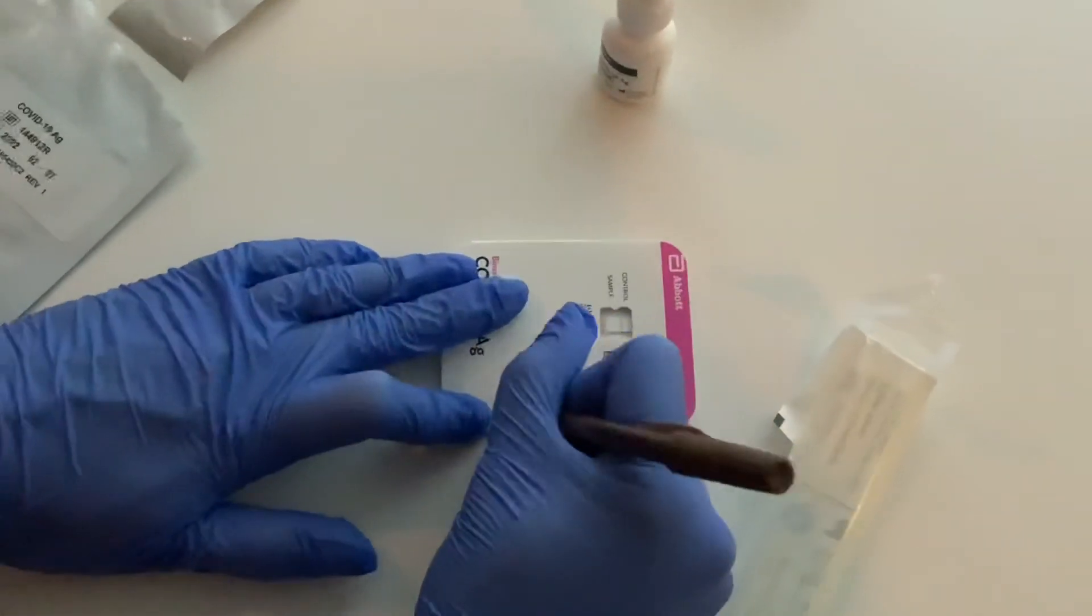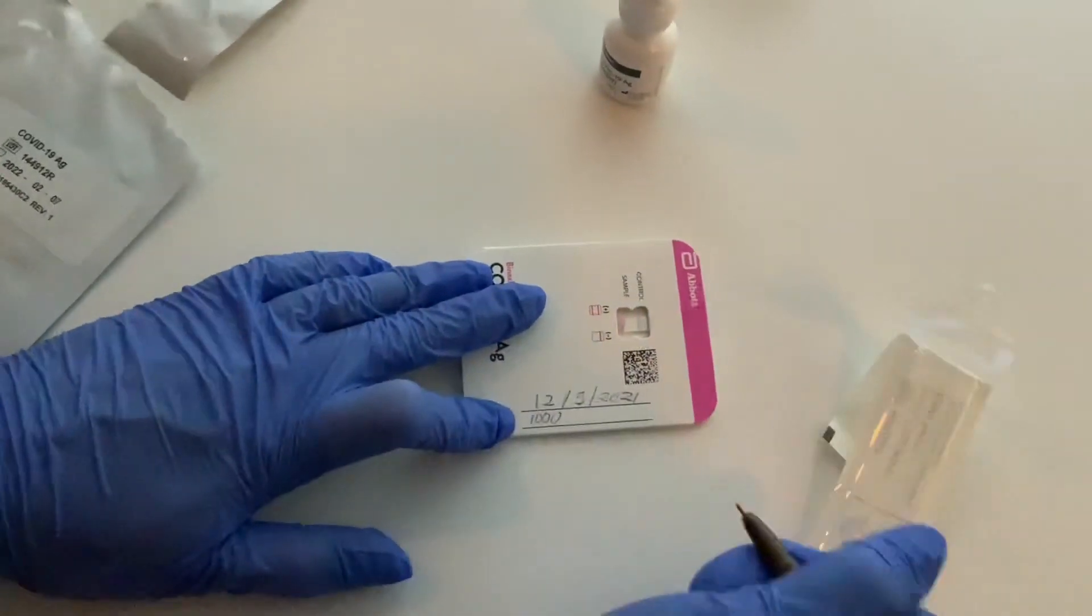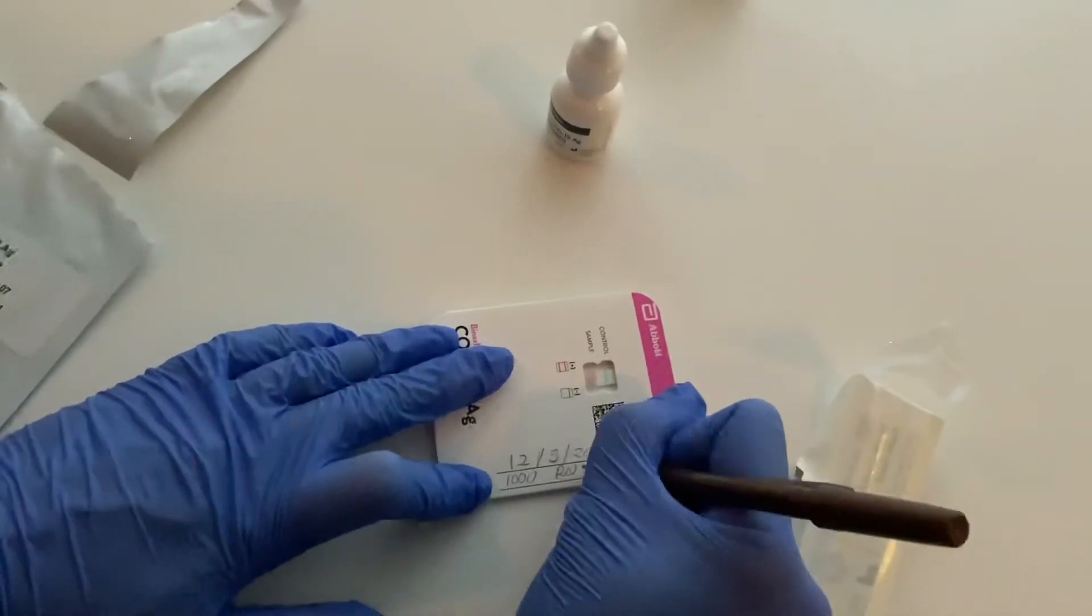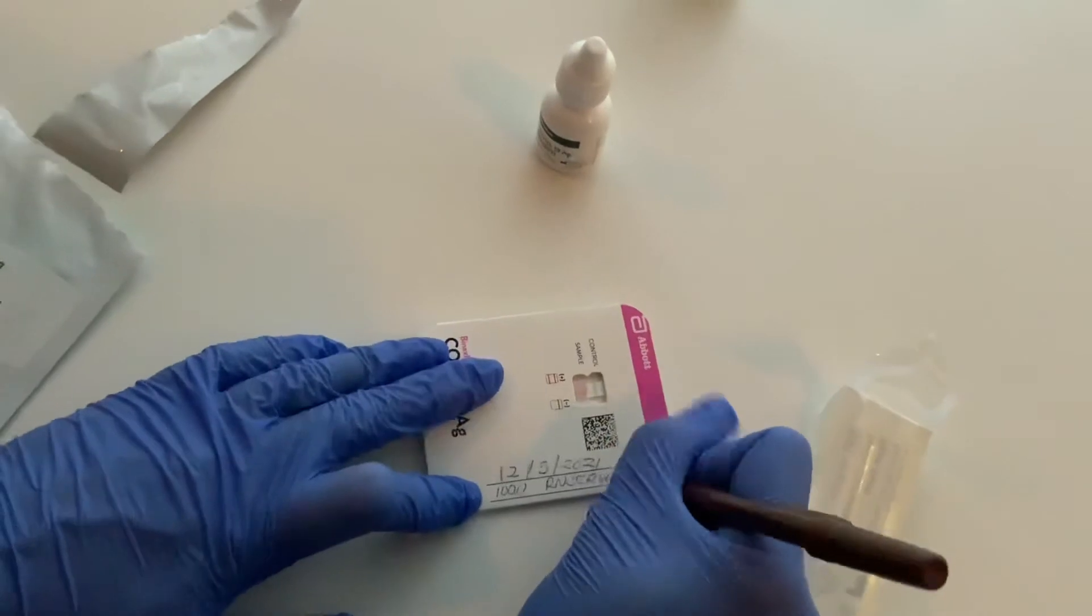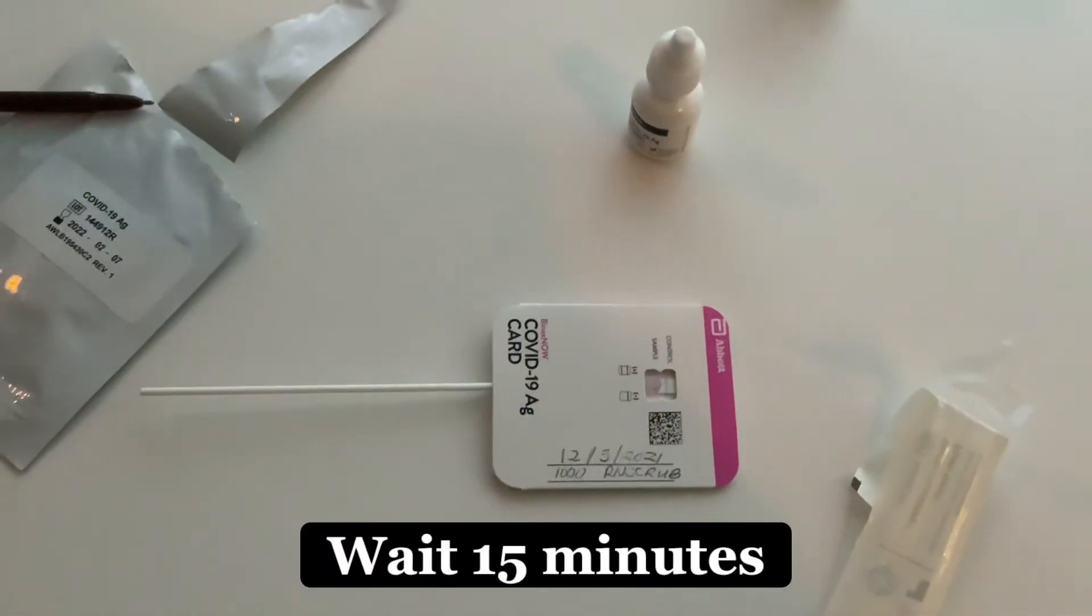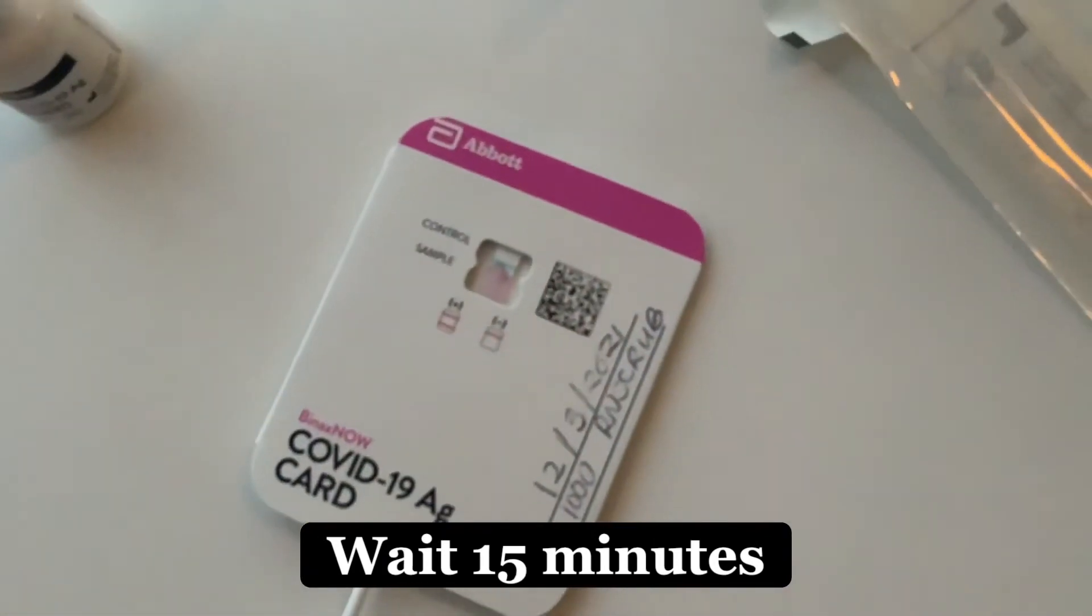And since this is only one patient, I'm not going to put the name down. Obviously if it's in a facility, you're going to put the name of the patient down there. But it is important that you remind yourself what time you started because this is a 15-minute test. And now we wait.